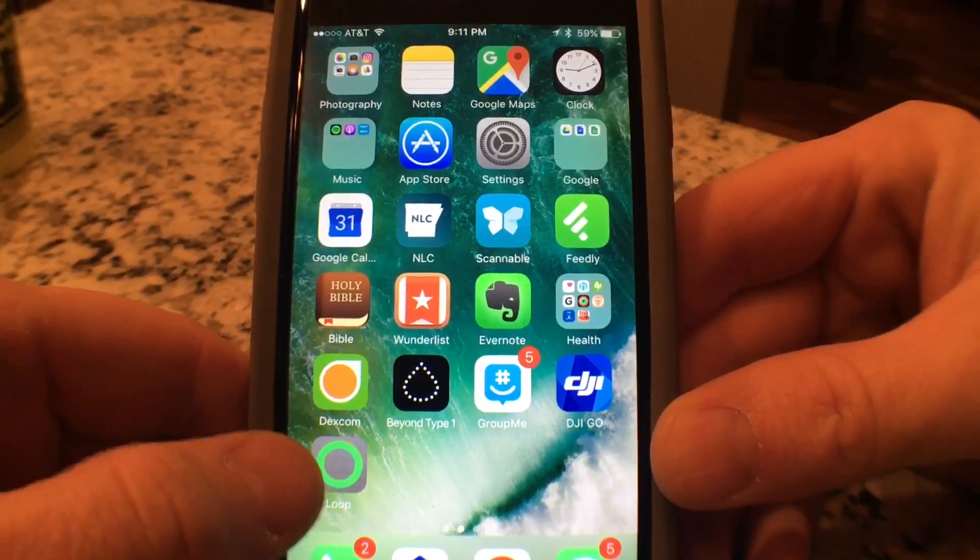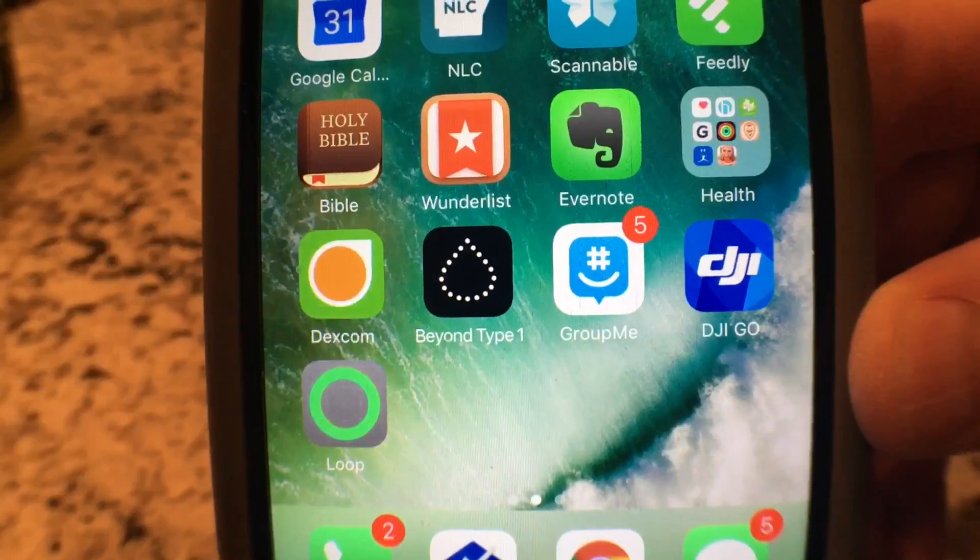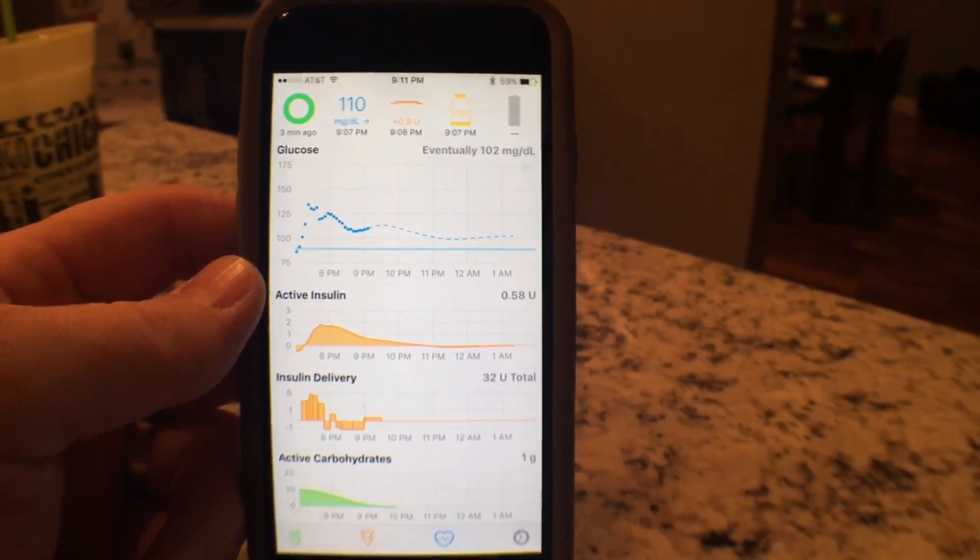I'm using Loop to close the loop between Dexcom and my Medtronic, my phone, and also my Apple Watch. I'm going to show you what the app actually looks like. Here is Loop down here, and there's Dexcom and Beyond Type One. This is what the app looks like.